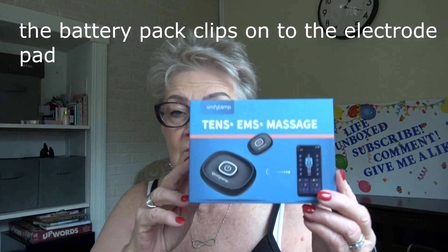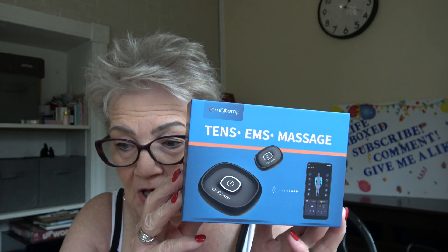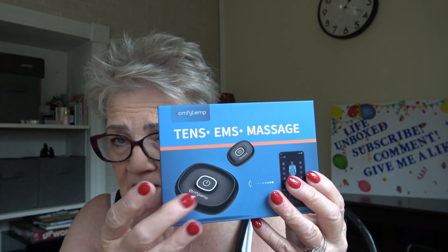This must be one of the battery packs — there are batteries and something in the back — and here is the other battery pack. Let me go back to the beginning: this is ComfyTemp, and I have reviewed products from them before — the knee brace and massager, the back massager, another EMS/TENS unit product. All the information will be down in the comments and I'll put a link for what I think is 20% off if you want to buy this unit.